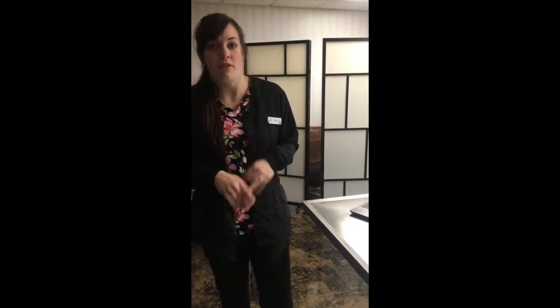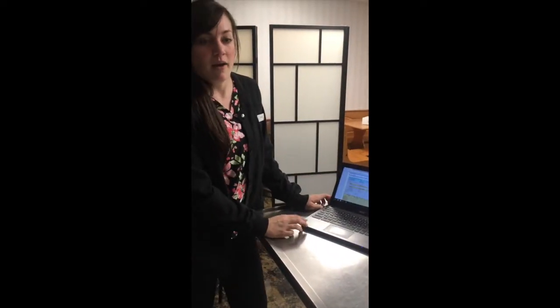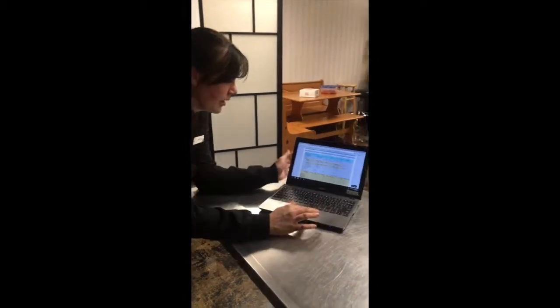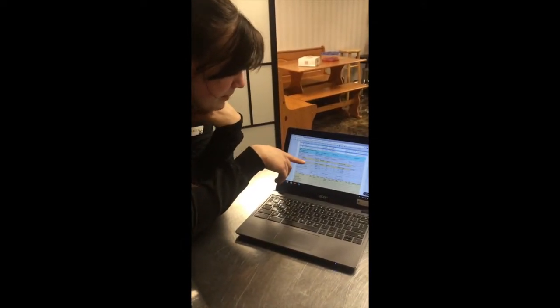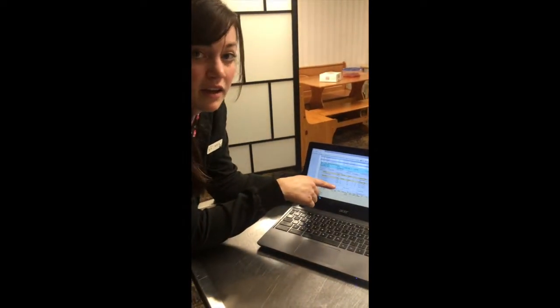Okay, I'm going to be discussing the effective anesthetic protocol to maximize pain management and provide adequate sedation for the patient. So once the doctor has done a physical exam and determined the patient's health and the safety of anesthesia, they will have chosen pain meds. This is Milo's anesthetic monitoring form. So we have the drugs that we're going to be using for Milo. For our pre-med pain management, we use injectable carprofen for our pre-anesthetic pain management.